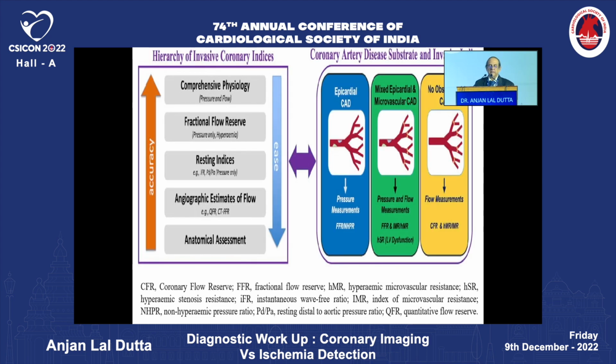The invasive indices on the left hand side, the more you go upwards: comprehensive physiology, fractional flow reserve, resting indices, angiographic estimates, and anatomical assessment.